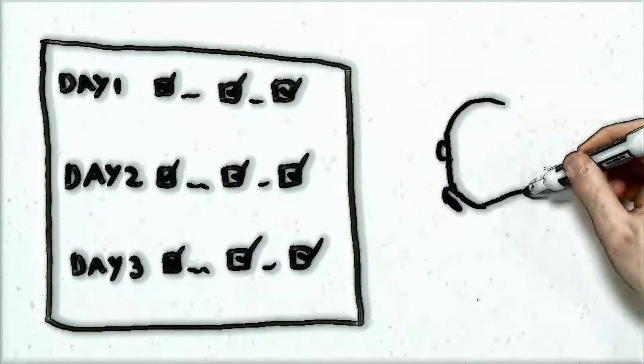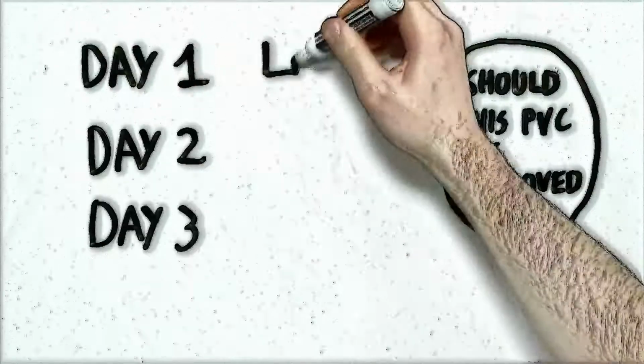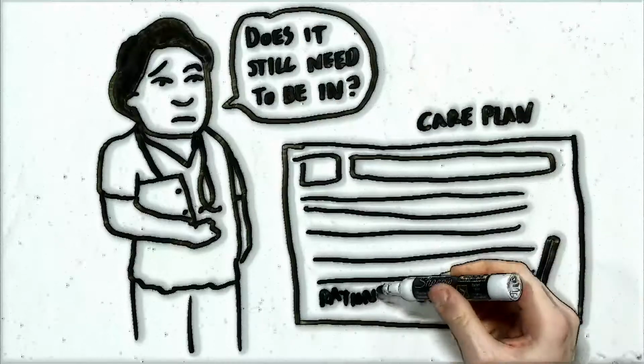A PVC can remain in situ for up to 72 hours, but should be removed after 24 hours if no longer required. If a PVC requires to remain in place for longer than 72 hours, this must be assessed by medical staff and an appropriate rationale clearly documented.